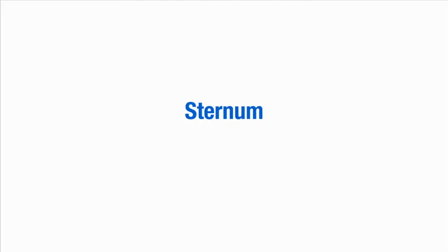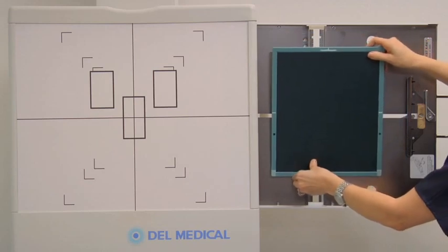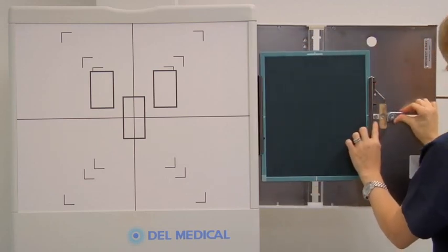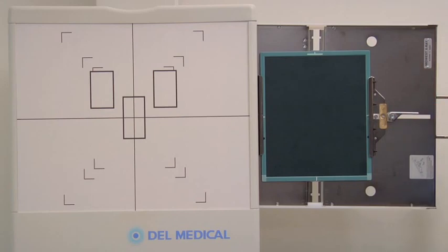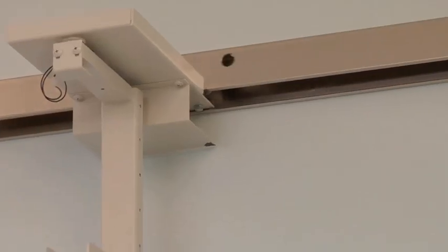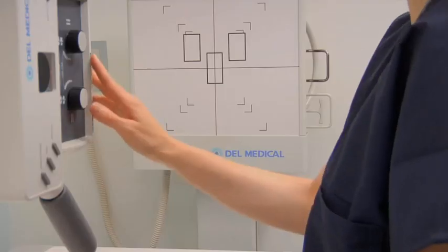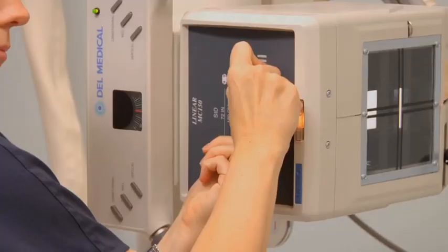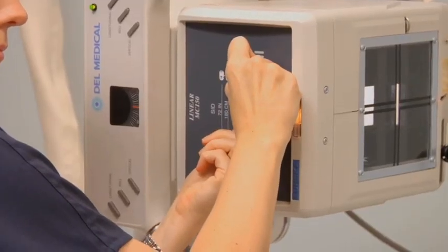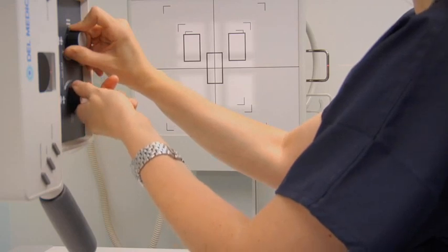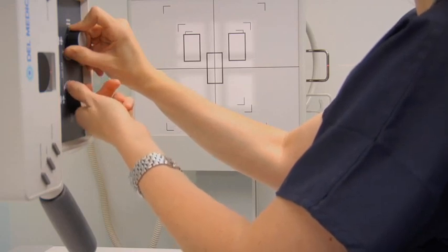To obtain a radiographic projection of the sternum in a PA oblique or right anterior oblique position, select a 10 by 12 inch cassette and orientate it lengthwise in the upright. Set the SID to 40 inches. Turn on the collimation light and align the central ray to the center of the image receptor. Collimate to the cassette size.